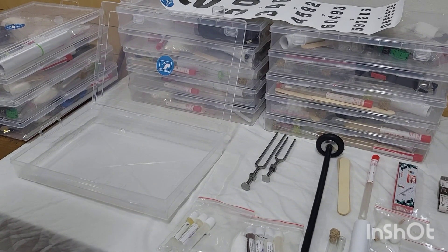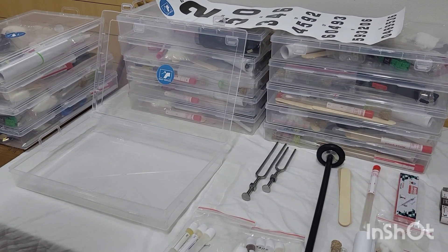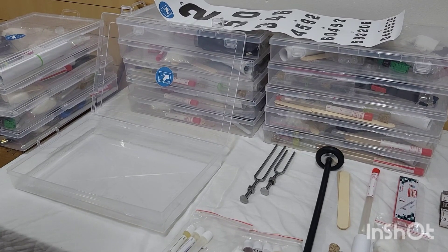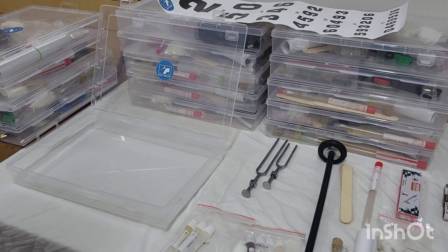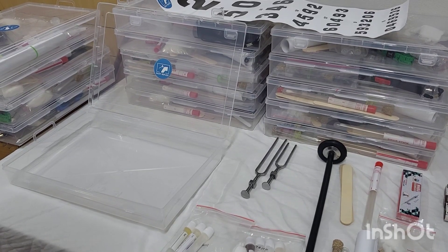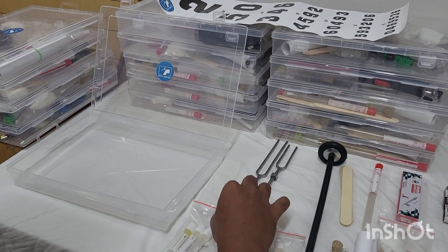Okay guys, let me just show you what are the items which we will be giving to you in our CNS kit. We have made work terribly simple for you, so you don't have to run to every corner to gather each and every item to place in the CNS kit.